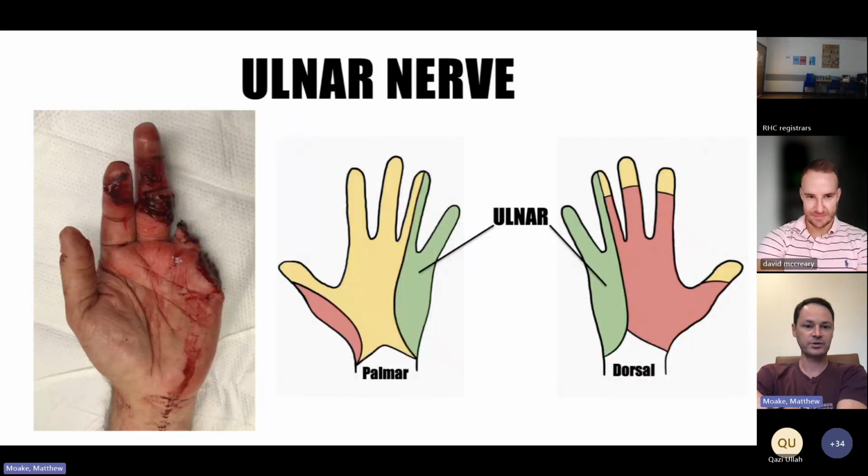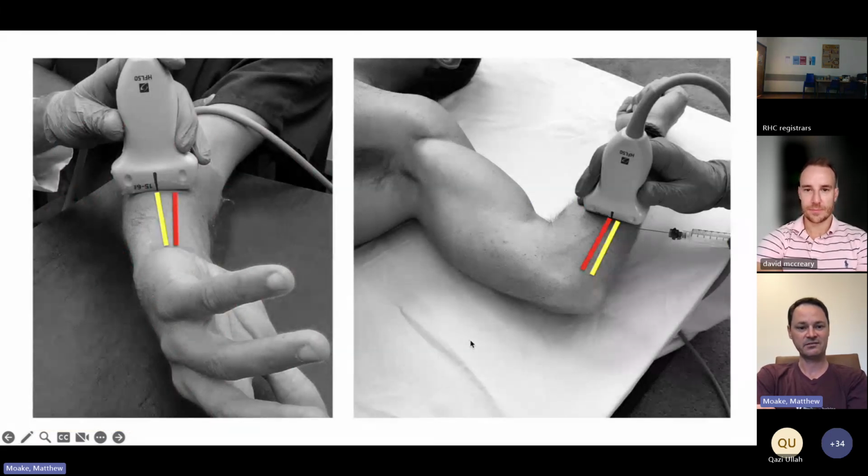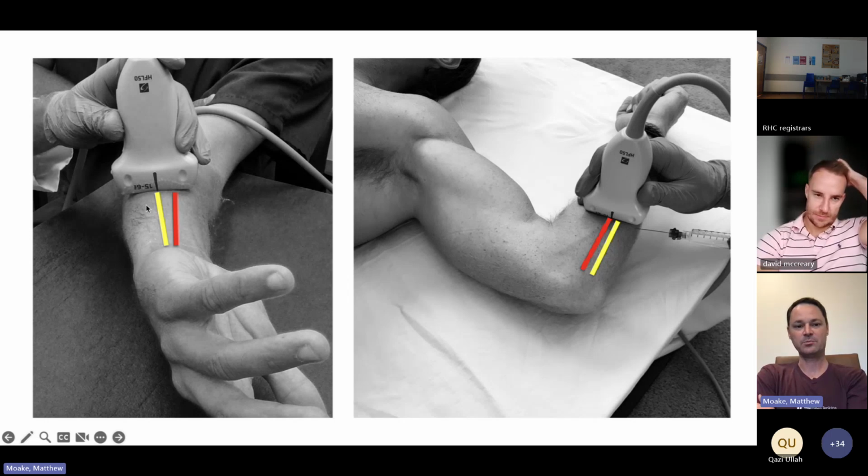And then last for the forearm, ulnar nerve, again going to be the pinky side. I will say I don't do a lot of ulnar nerve just because the distribution is so small that if you're doing the pinky, you can also just do a digital block. It's also pretty tricky to get at anatomically in the forearm because it's well into the ulnar side. So you often have your patient torque their arm pretty good to be able to get an angle where you can approach it.